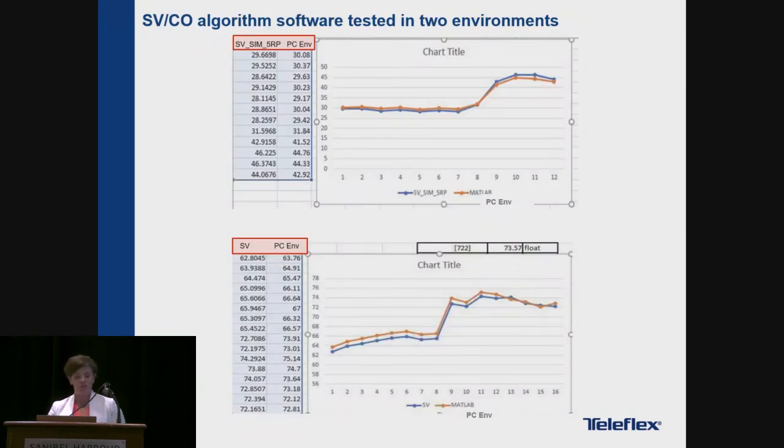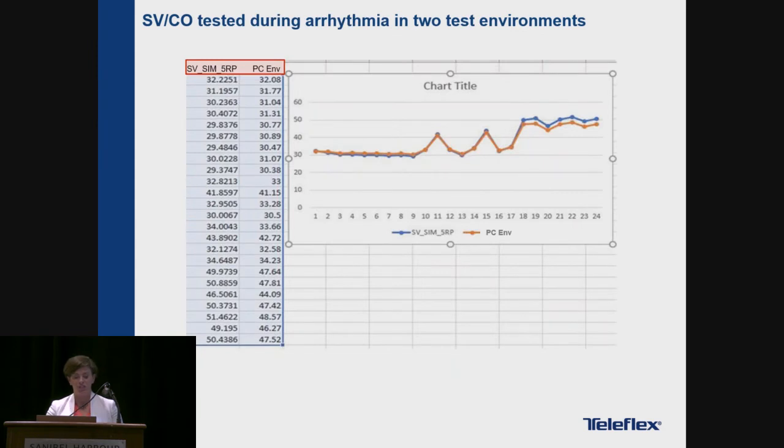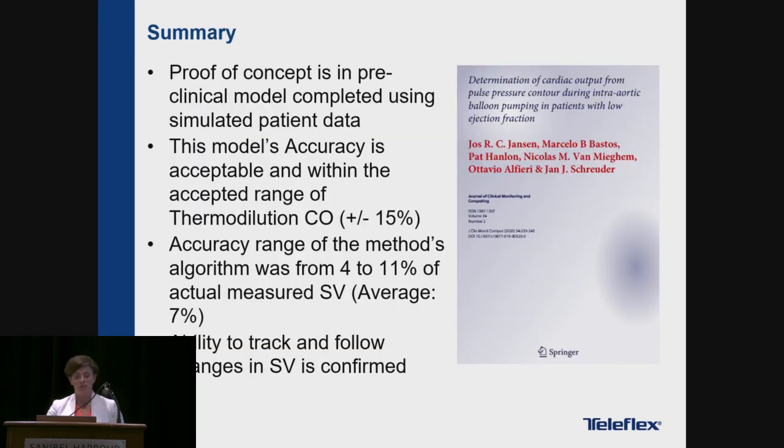Now, these are graphs showing the performance of the stroke volume calculation in a balloon pump as compared to the computer program that the algorithm was developed in. The performance of the algorithm in the pump is virtually the same as the algorithm as it was originally developed. These graphs confirm that the pump is able to calculate and follow the stroke volume changes. This graph shows us from pump off to pump on, again, the worst case scenario for accuracy, comparing the algorithm's performance in the balloon pump as compared to the original computer algorithm. Again, this confirms that the balloon pump algorithm is implemented correctly and working as well as the original.